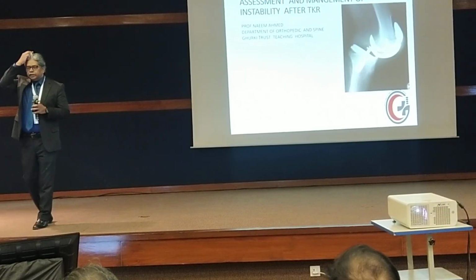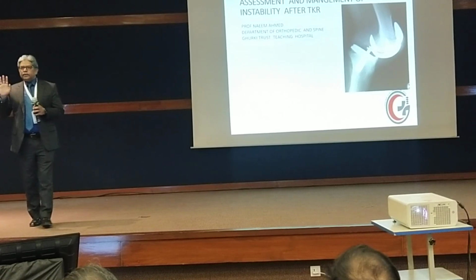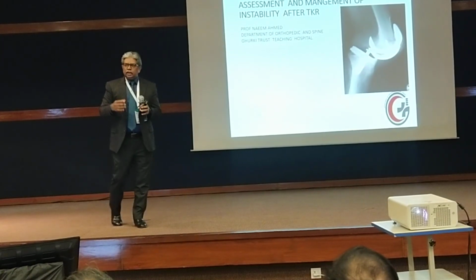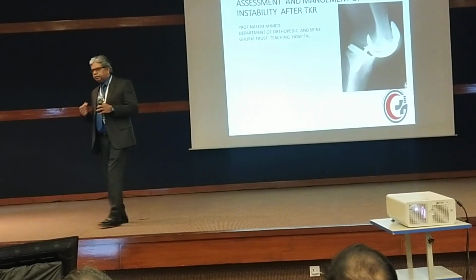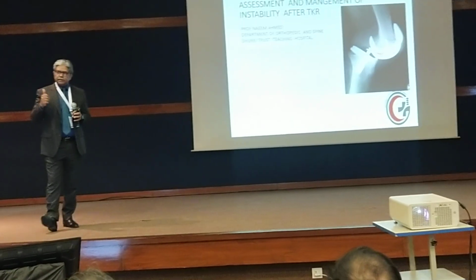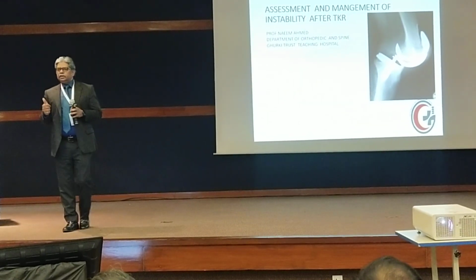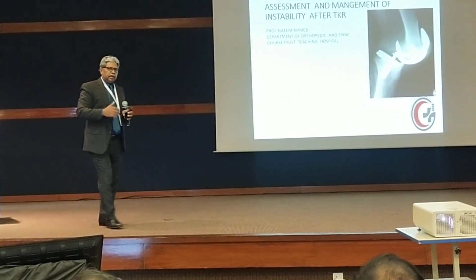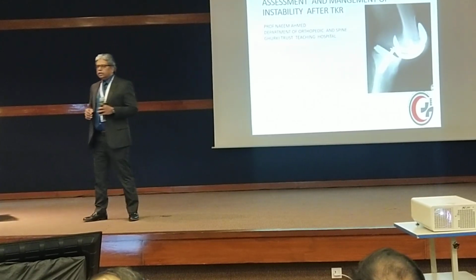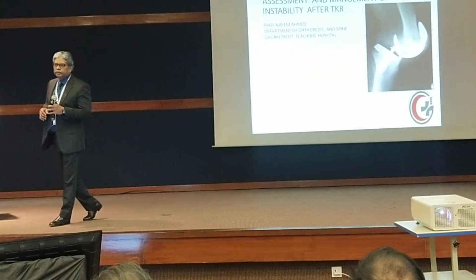And how to rectify? If the femoral component and tibial component are not too much faulty, and you flex the knee, check the position of the patella, and it remains out, the first thing to perform is lateral release of the lateral retinaculum. If the patella moves now in the socket, okay. If not, is there any other way?